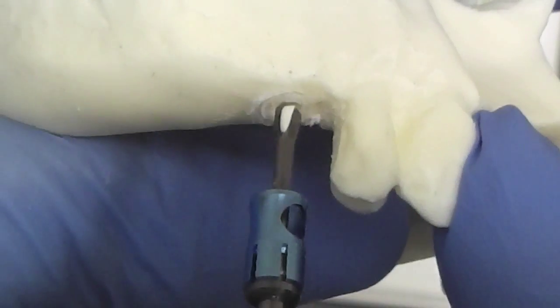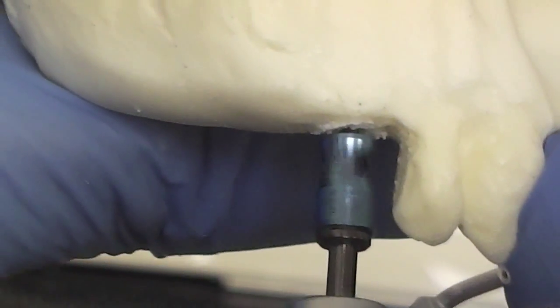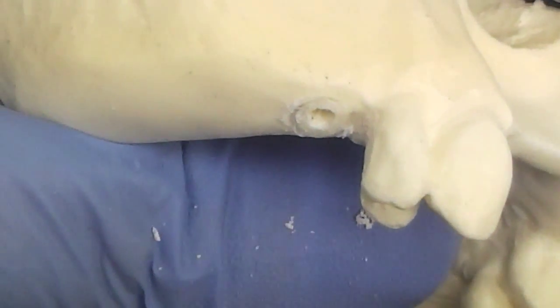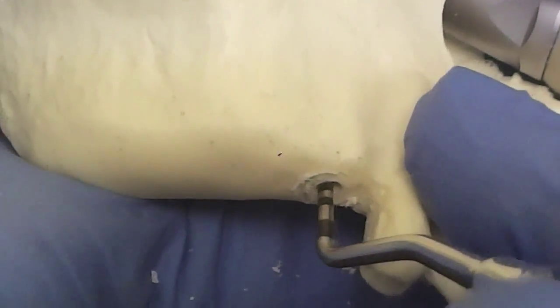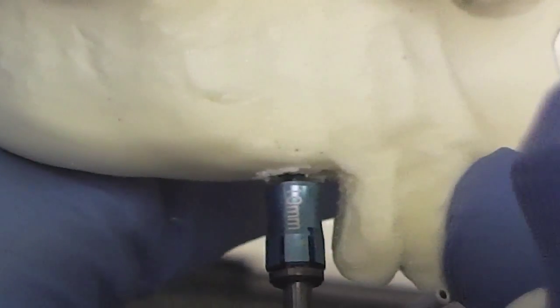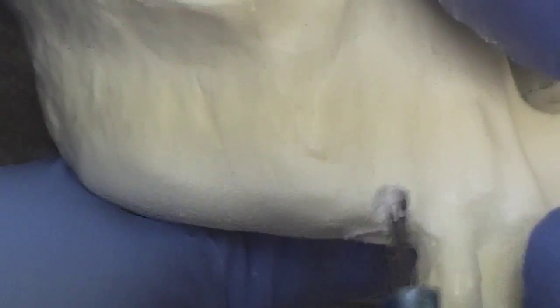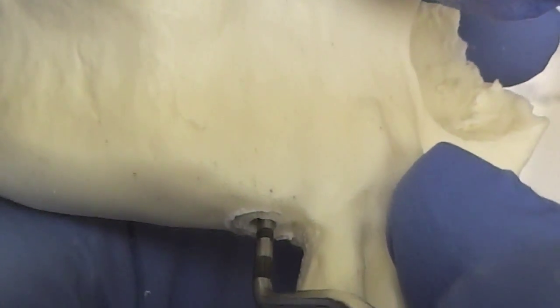Now the 9 millimeter stop is in place. You have 1 millimeter to go. We have performed our osteotomy. We're going to check our depth, and we're still solid. We have our 10 millimeter stop in place. We're going to insert the instrument. We have 1 millimeter to go. We're going to check our membrane, make sure it's okay, and we have lifted. You can feel the rubbery surface of the membrane.